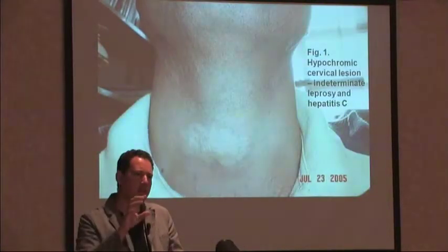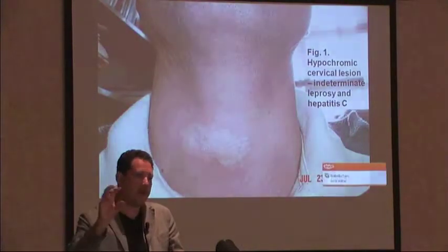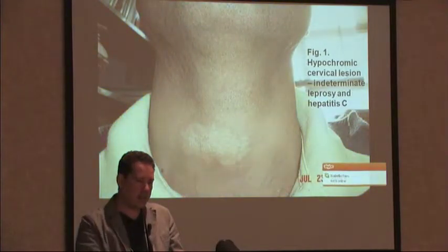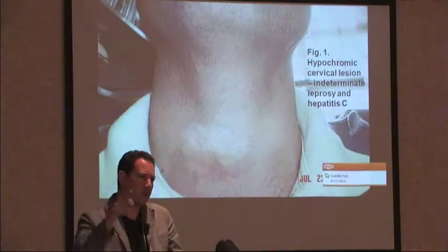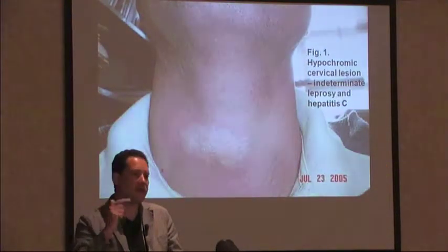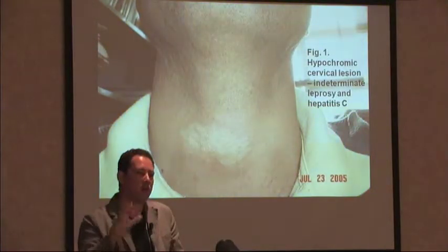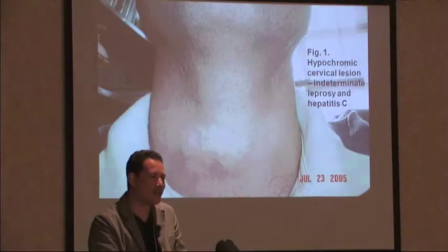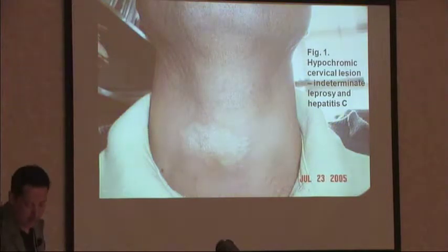Then I made the thermography, and he said, I will start a treatment, and I would like you to make different images along my treatment. I started to do this, and he asked me, why is today different, your temperature runs here. He put a lot of problems to me, and he established, why don't you use normalized temperature? What's this? Oh, it's a poor man's solution. So we started this work with our advisor's experience.